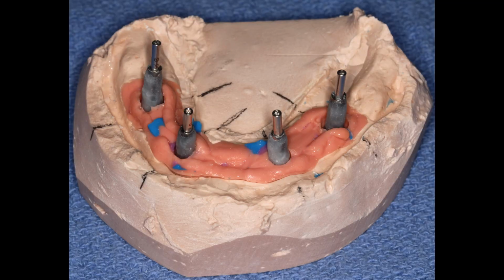This is our first implant model. It looks a little crude, and it is, because we're using this just to make temporaries. We'll come back a few months from now and make much prettier final impressions, which will generate a much nicer looking master cast. But what you see here is the stone. It's holding analogs, which are the implant representation in the model. They're little titanium analogs that have the same diameter and the same timing of the implant in the mouth. Then you'll notice the pink tissue that I showed on the previous slide. I now have a representation of the tissue itself.